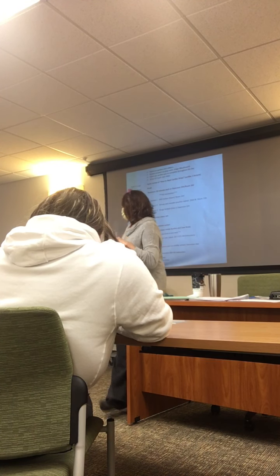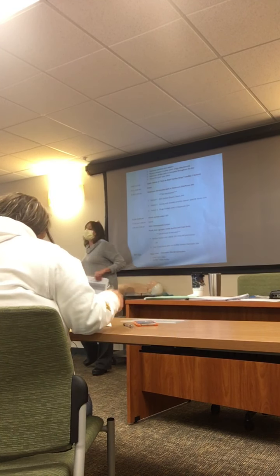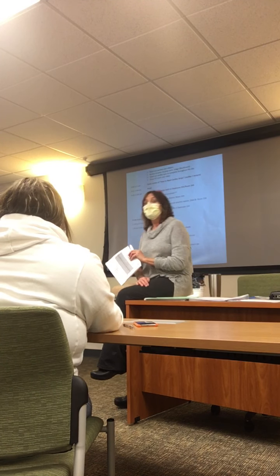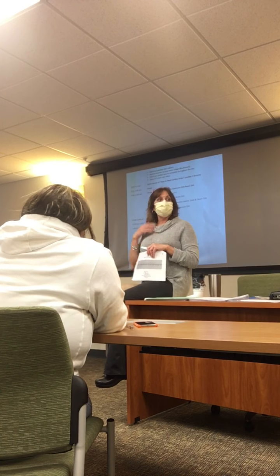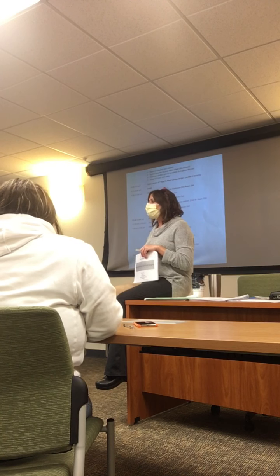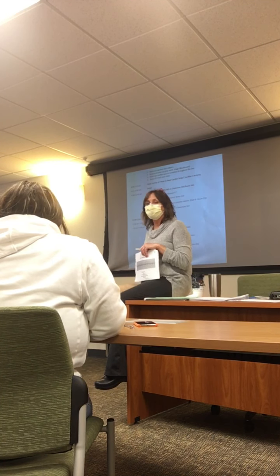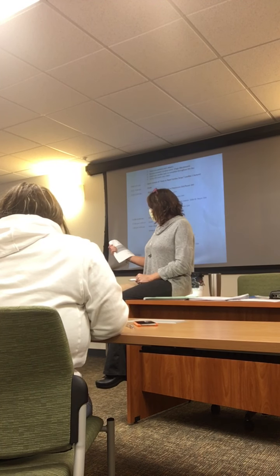All right, the next one we're going to do is sinus tachycardia. What kind of people normally have sinus tachycardia? What patients have you taken care of that have sinus tachycardia? COPD patients, a lot of times because they're hypoxic, their heart rate's faster. Babies, if you've been to labor and delivery or worked in pediatrics at all, their little heart rates are so fast it's hard to find all the parts because it's going so fast.